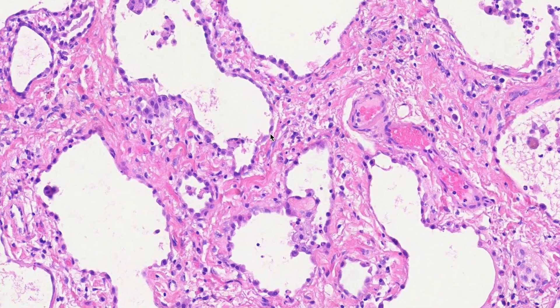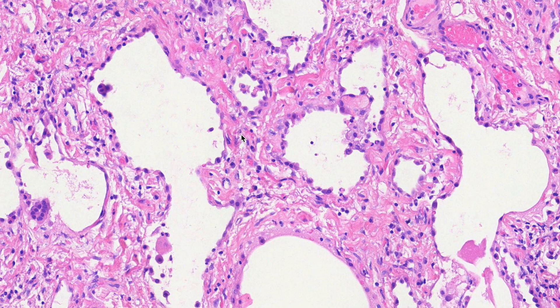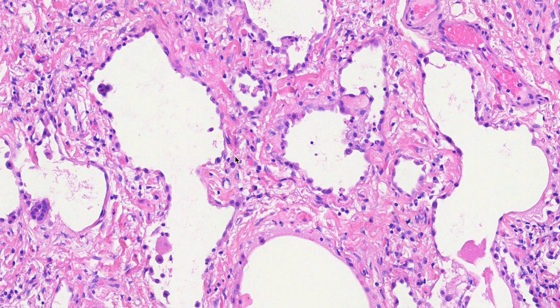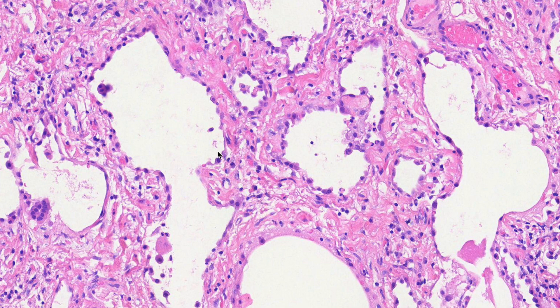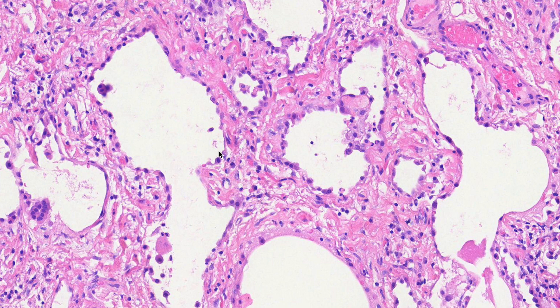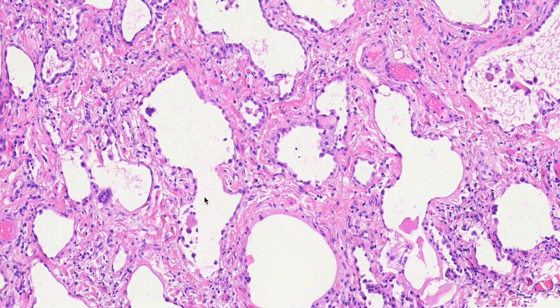You can see why this would cause a relatively high degree of lung impairment, because instead of the nice thin alveolar septa that allows for efficient gas exchange, the air has to diffuse all the way from these air spaces through these thickened alveolar septa into the capillaries.